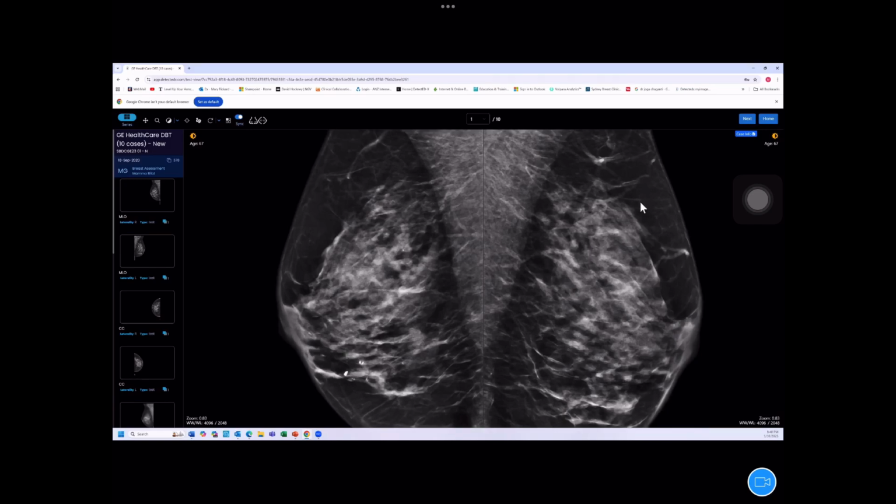And this is a fairly subtle case, I must say. In fact, quite a few of these cases are quite subtle. So if we compare, when we zoom up, we look from side to side and look to see whether there are any differences and any calcifications that we might see which we didn't see or weren't as obvious on the non-zoomed images.